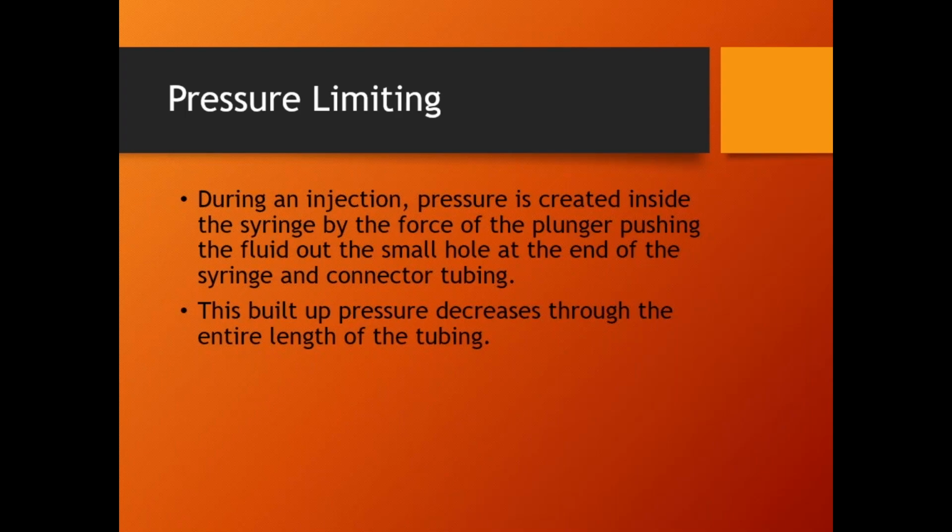Unlike an infusion pump, when an infusion pump hits its pressure limit, it stops infusing. That's not the case with contrast injectors. If a contrast injector hits its maximum pressure, we don't want to stop the injection. Why wouldn't we stop the injection? Anybody guess? No reason for you to know. Nope. Good guess. Patient's already here. Other than this fluid right here, what else are we firing into the patient at this exact moment?